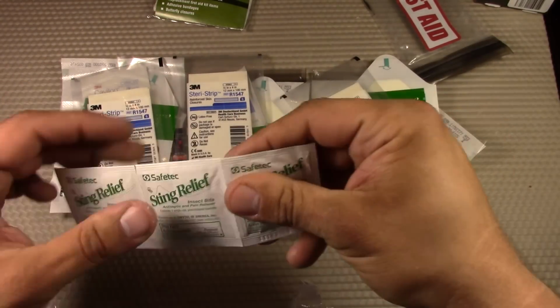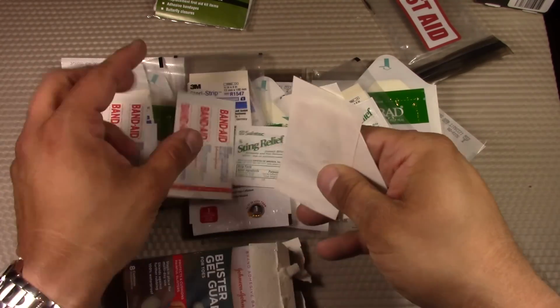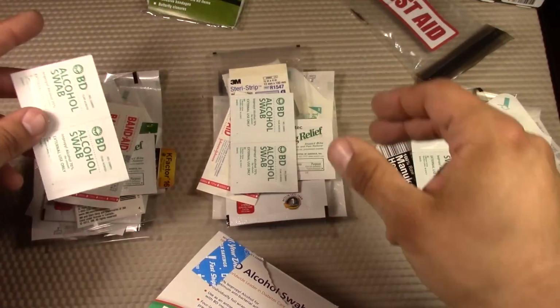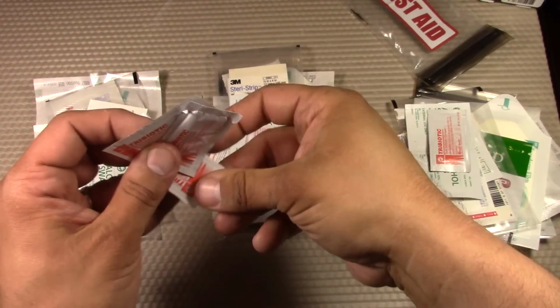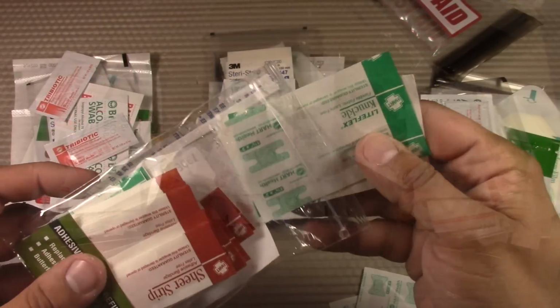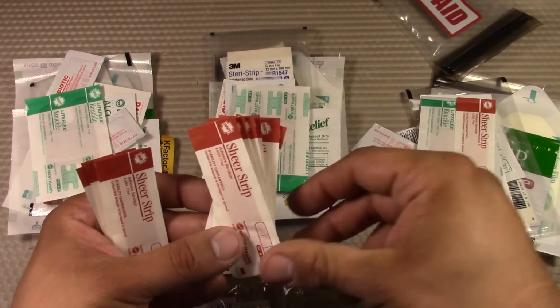Some sting relief for blisters. Some triple antibiotic ointment. And last, some Band-Aids. Let's start off first with the knuckles and several Band-Aids.